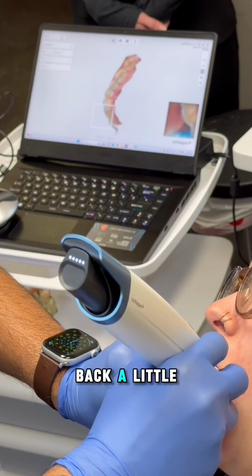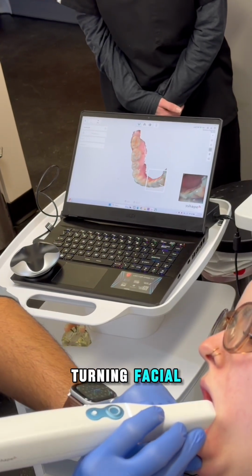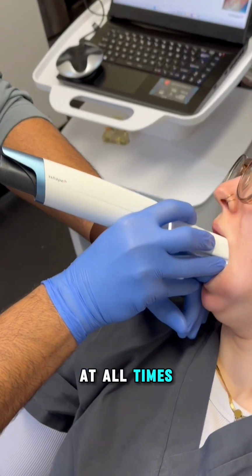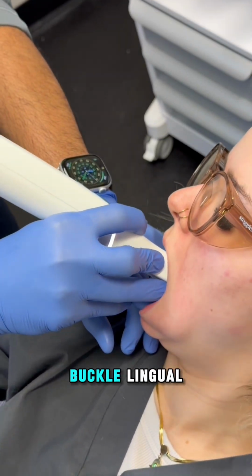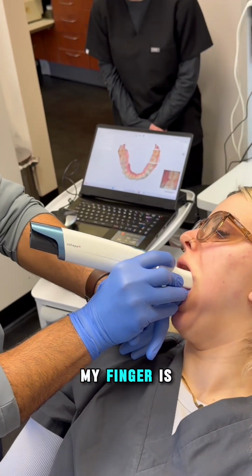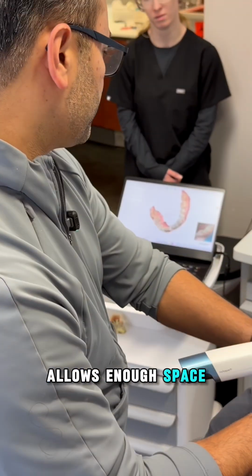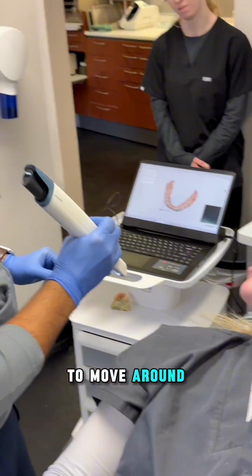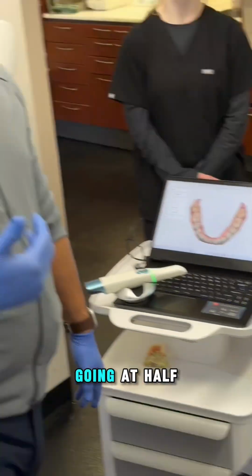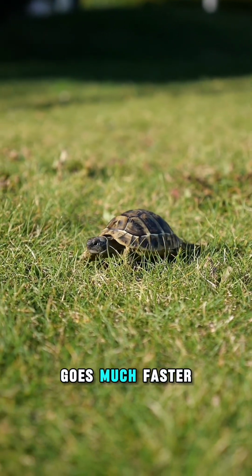Again, I'm gonna go back a little bit, turn lingual. Now again, I'm turning facial. Look at how my finger keeps retracting the cheek at all times. Again, I'm going buccal, lingual, buccal, lingual. My finger is still retracting the cheek at all times so that it allows enough space for the scanner to move around. That's it. Wow. Close. So this is me going at half the speed than what I usually will, right? So this goes much faster.